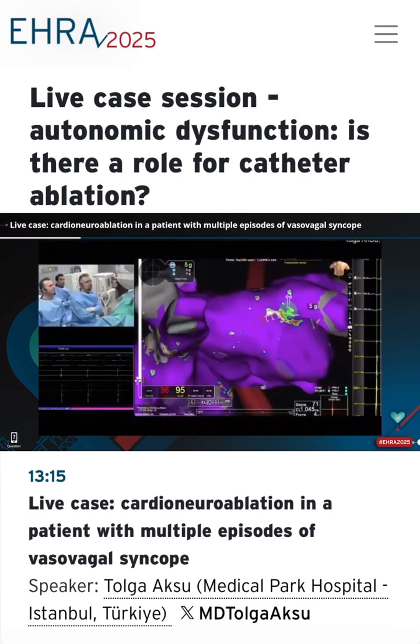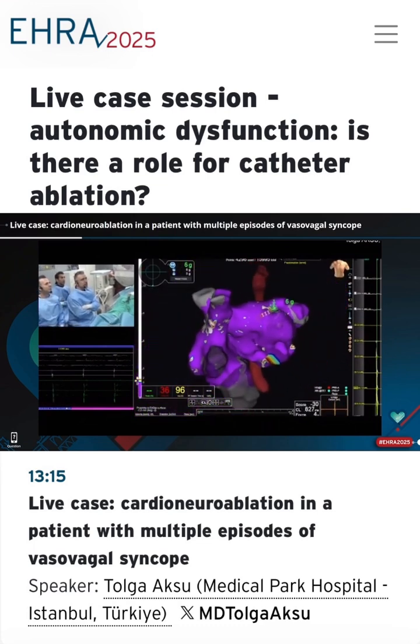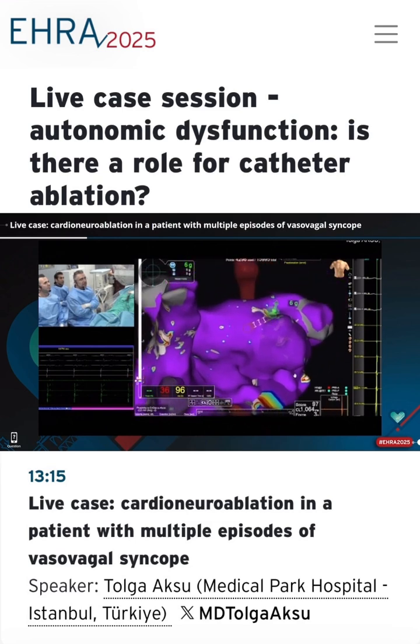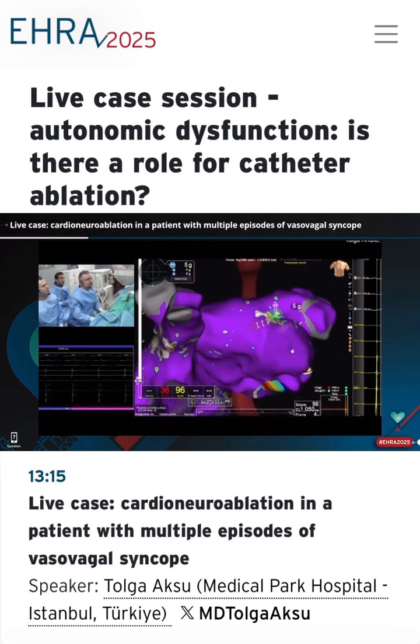What we did, we mapped right and left atrium, and we used fractionation mapping software first to calculate the fragmented electrogram. In this map, the white area shows electrogram with more than 2 deflections. You see the left superior GP, our ablation catheter contact in there.